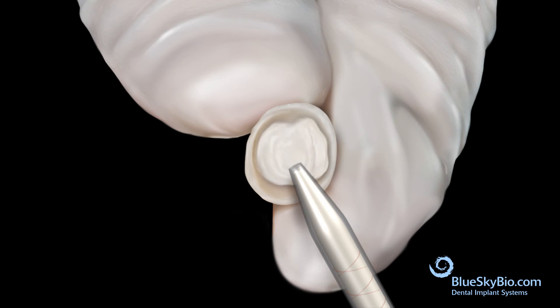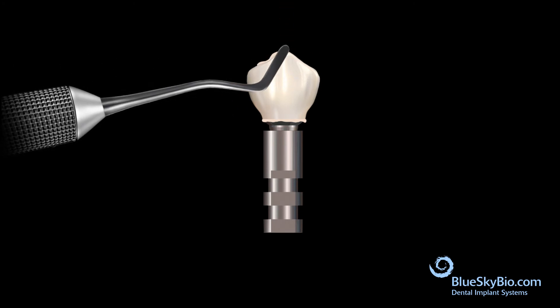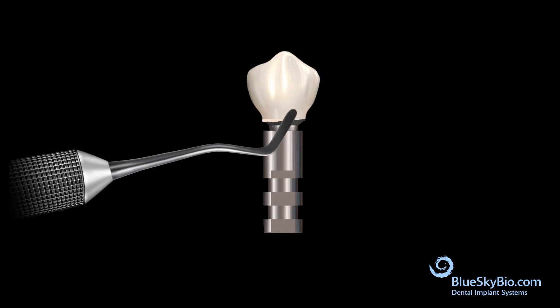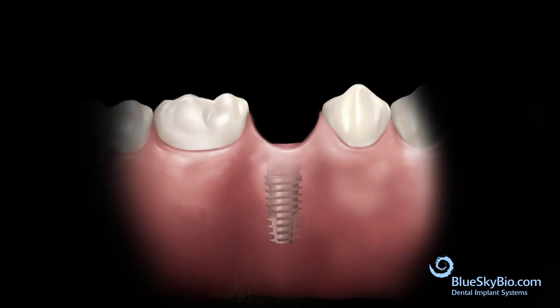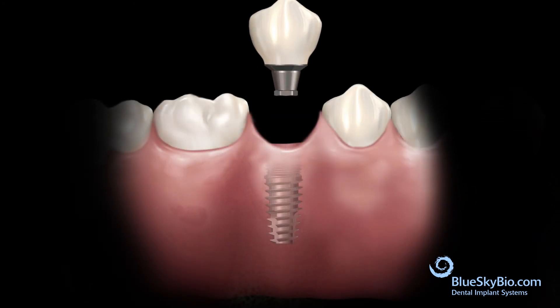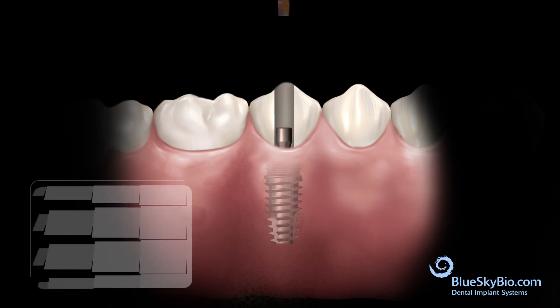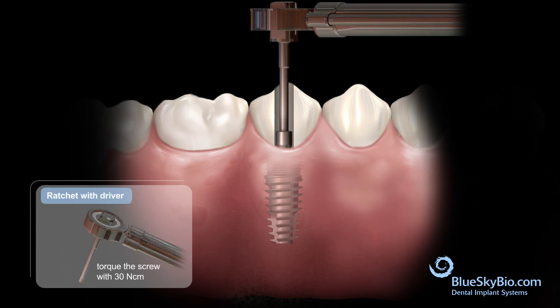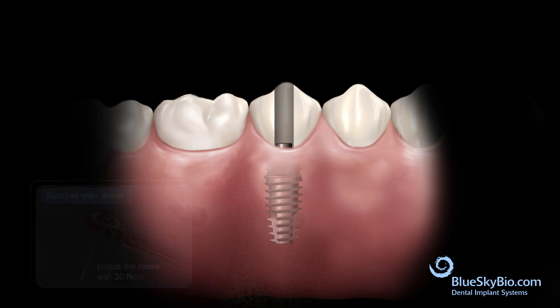Insert bonding material into the crown. Remove the wood stick and remove any excess bonding material. Remove the crown and abutment from the analog. The restoration is seated and the screw is inserted and torqued to 30 Newton centimeters.